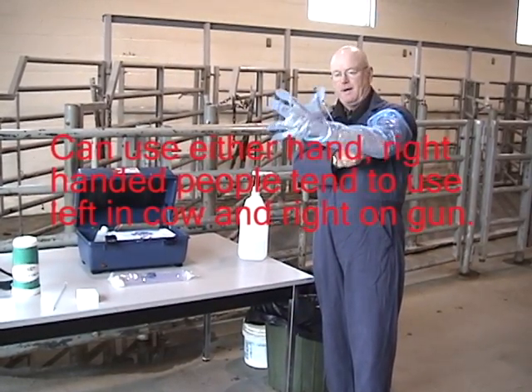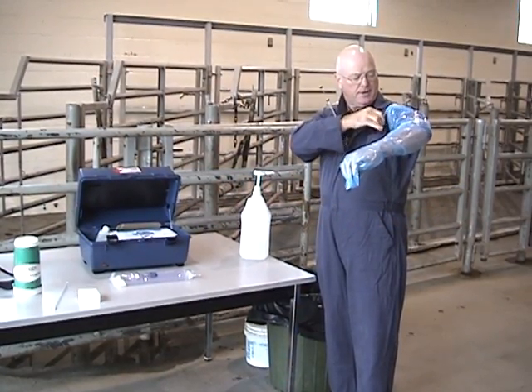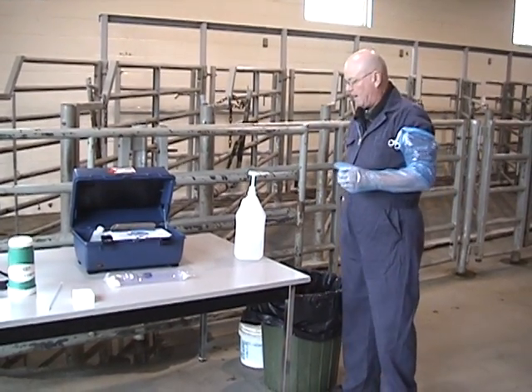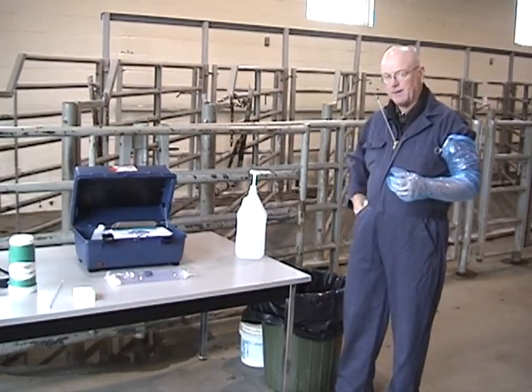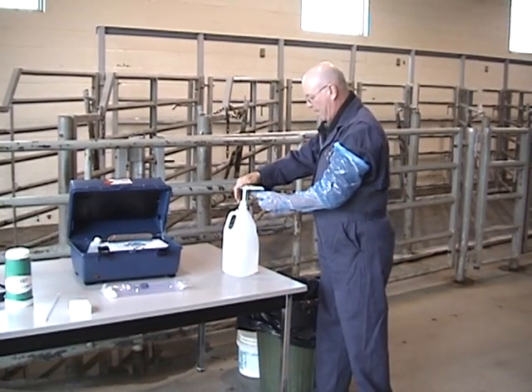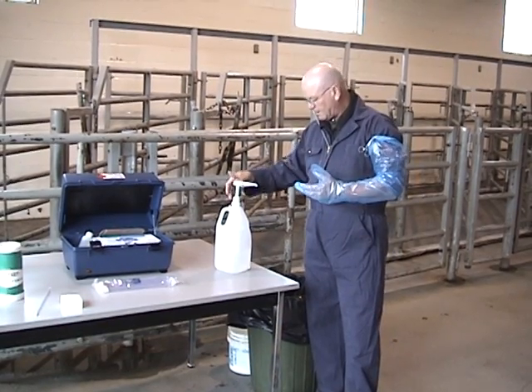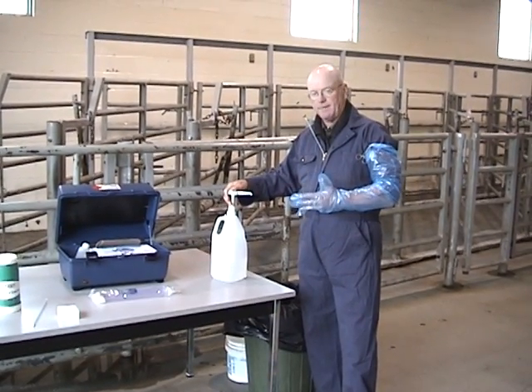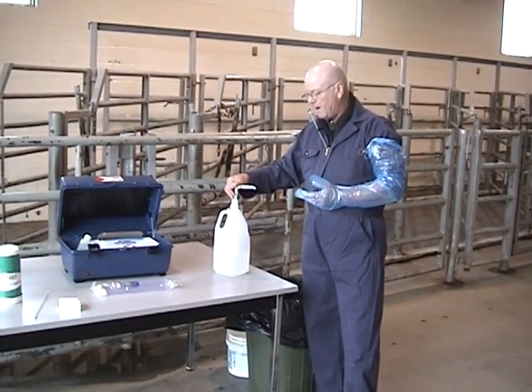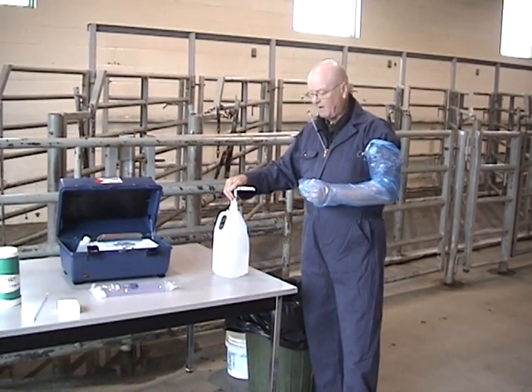I'll pull it up. I've got a small hemostat here that I use to clip and keep it up from falling back down. You can also use an elastic band if you wish. I also have paper towels ready to wipe the cow off with. Now I'm going to use some lube — it's critical that you do use lube. There's mineral oil, which is what we have here. There's also an AI gel that can be used, or a small amount of vegetable soap.